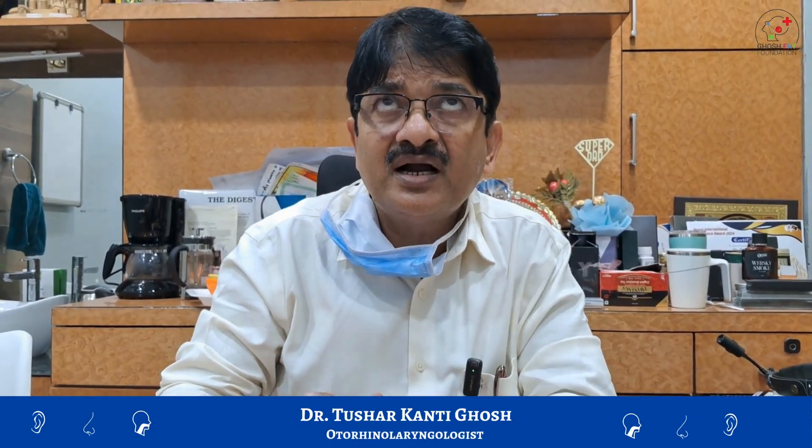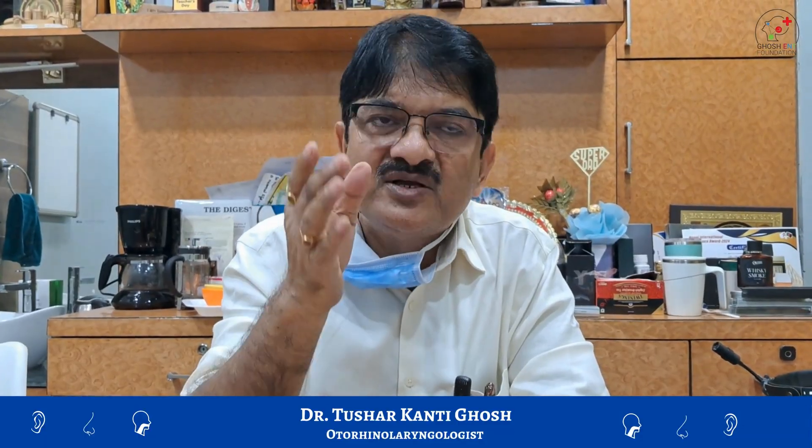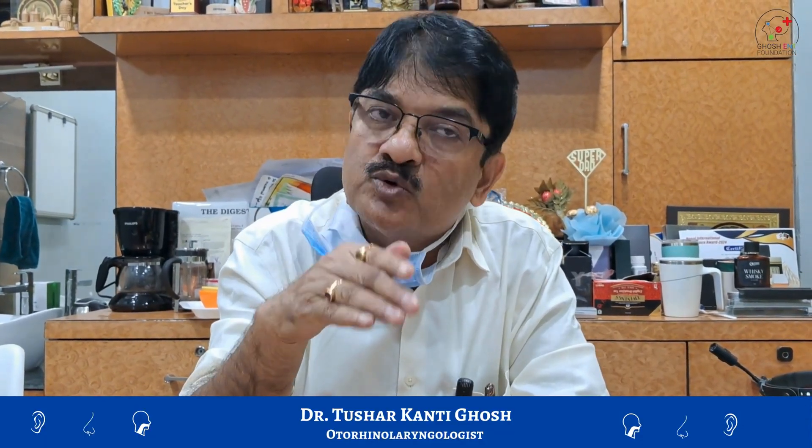Good morning. In this case I will show endoscopic turbinoplasty with micro debriders for inferior turbinate hypertrophy — a very common surgery done every day. With cautery or other methods there is shearing of the normal mucosa of the turbinate; we avoid that by doing turbinoplasty within the turbinate.